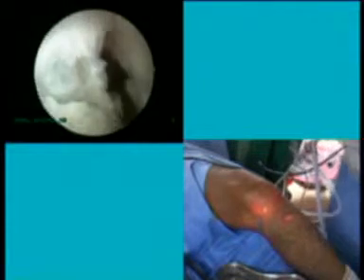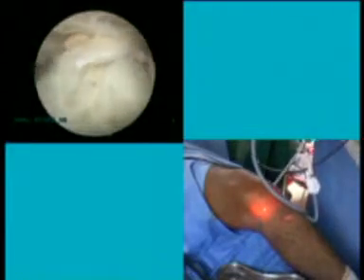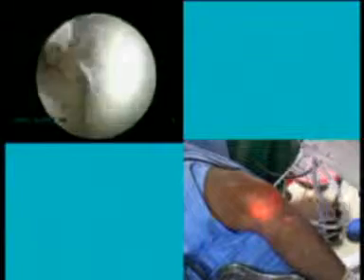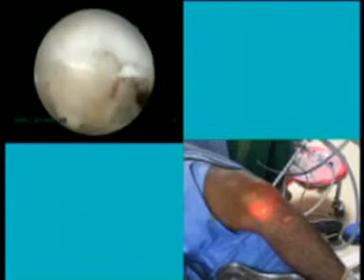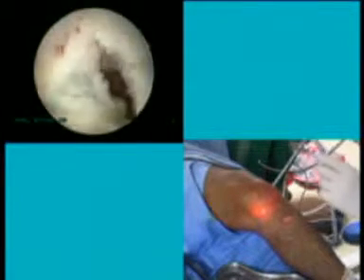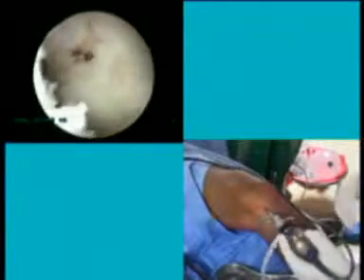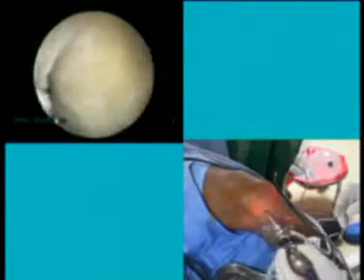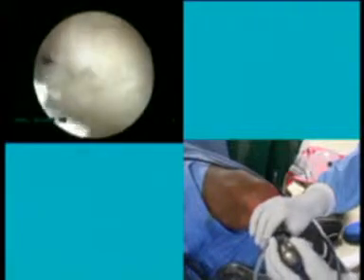with the tunnels. I have already debrided the ACL remnants. There was almost no ACL in this joint. And I did a little notchplasty, because it was a quite narrow notch, and there were some ossifications in the notch. So now we have a nice overview of the femoral lateral notch wall. But if you put your scope in the anterior medial portal, you get a much better overview. Here you can see my notchplasty. Then we go backward.